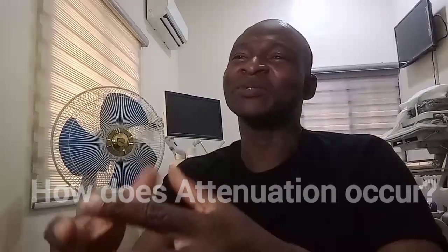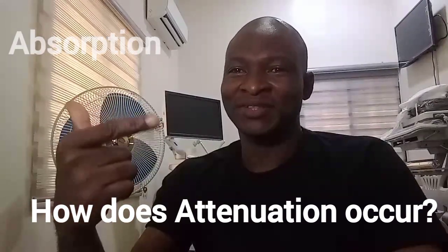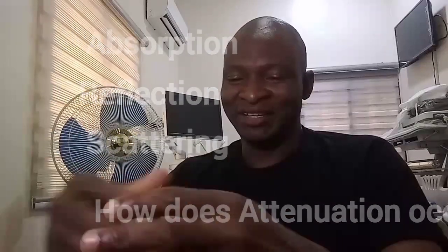So how does attenuation occur? Attenuation is caused by three different processes: absorption, reflection, scattering. Absorption here is the conversion of ultrasound energy into heat energy within the tissue. Absorption is the primary mechanism of attenuation in soft tissue. As ultrasound beam travels through normal soft tissue, approximately 80% of the sound beam energy is attenuated by absorption. That's to say, absorption of sound energy and conversion to heat energy plays a role in a potential adverse effect, which we'll look at in biological effect.